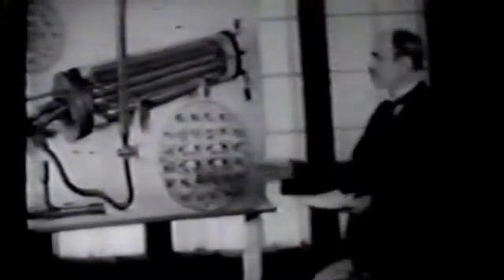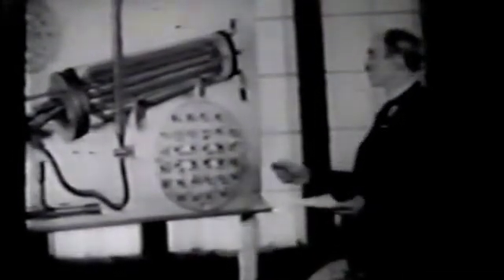Outside of these tubes, in this large apparatus, is contained a physiological salt mixture. This mixture is in osmotic equilibrium with the blood and prevents the escape of salt from the body fluids. The red corpuscles of the blood and the large protein molecules remain in the bloodstream as it circulates in this apparatus. And only the diffusible crystalloidal substances, and some that are not crystalloids but consist of small molecules, escape through the celloidin tubes into the outer fluid.